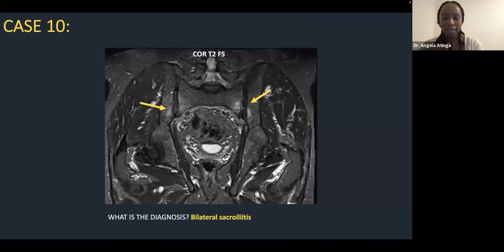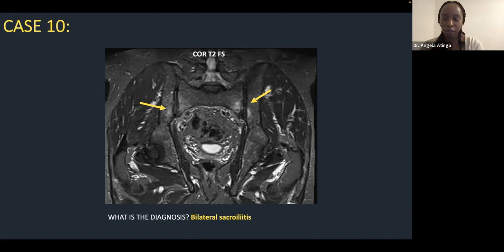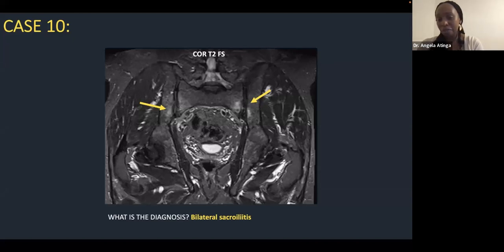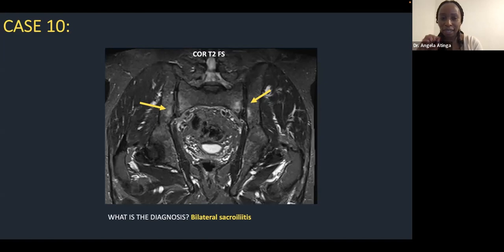Case 9: bilateral sacroiliitis. This young patient presenting with nonspecific hip pain had no hip pathology, but the problem was posterior. You should think about ankylosing spondylitis, IBD-related sacroiliitis, or in a recently pregnant woman, pregnancy-induced sacroiliitis. This case highlights the importance of looking at every single sequence and every single image — the patient came for hip pain, but their diagnosis was found elsewhere in the field of view.